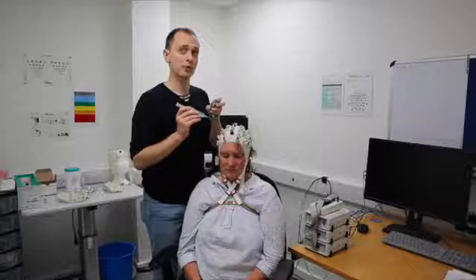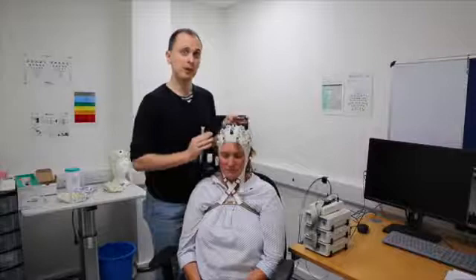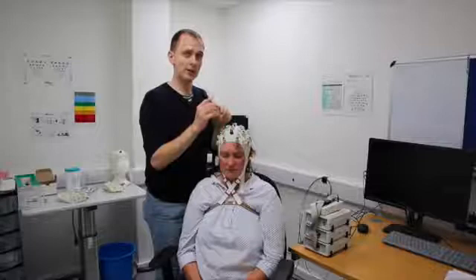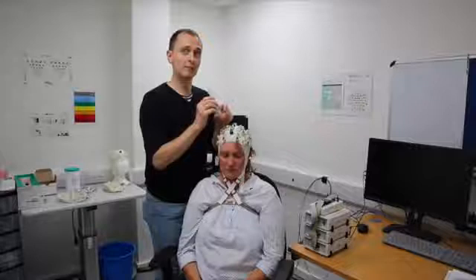Occasionally some electrodes are more fiddly than others, especially down on the sides and back or anywhere the cap is loose. In that case you may need to put a little bit more gel or wiggle the needle around a bit more. You're not trying to scratch the participant's head too hard — you're just trying to push hair aside and make sure the gel is making contact with the skin.